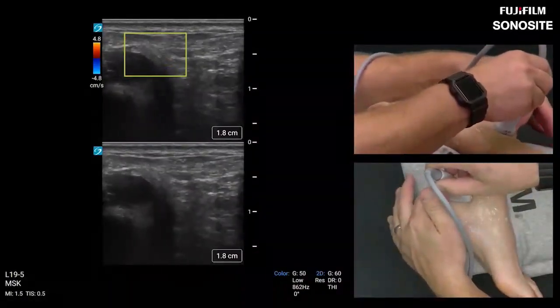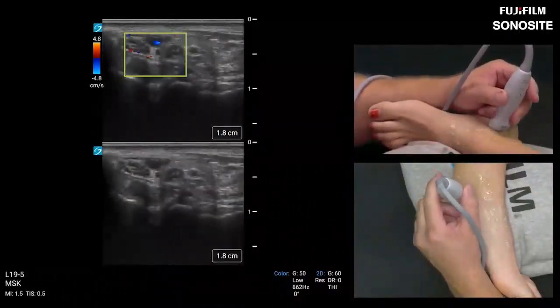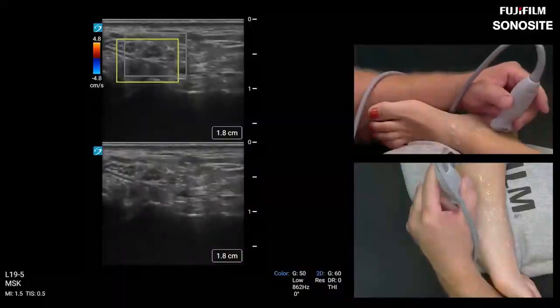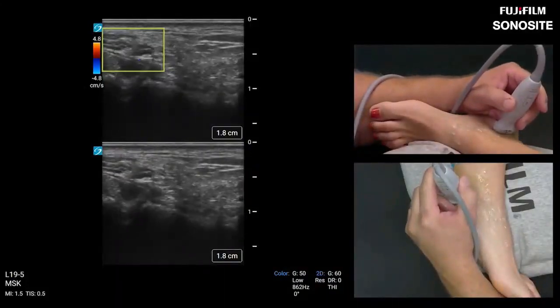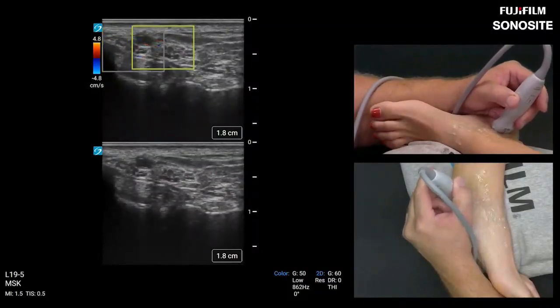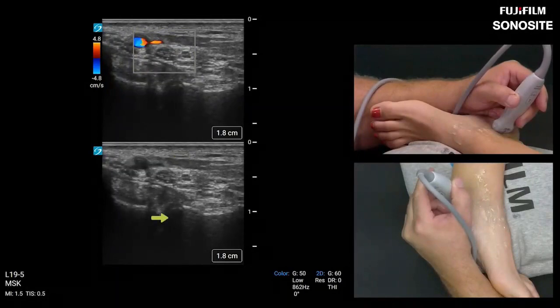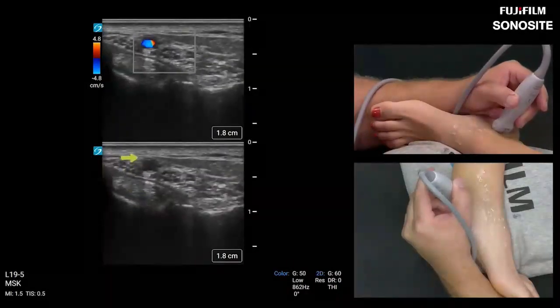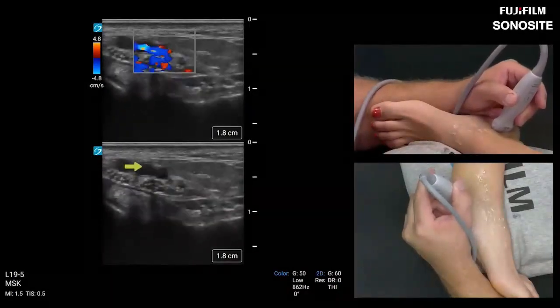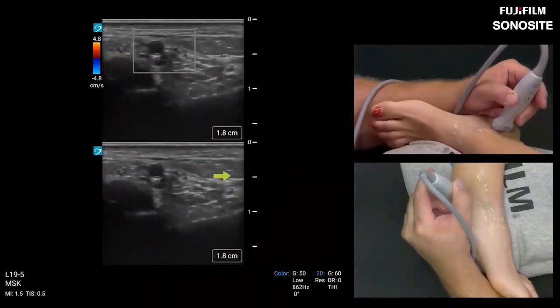And we could be running a needle underneath the vessels and underneath all the scary structures into that posterior subtalar joint while simultaneously having color on. So we would see the procedure showing up at the bottom while we're still live. We can still see the artery, we can still see the veins, and not interrupt our procedure with all that flash artifact from a needle.